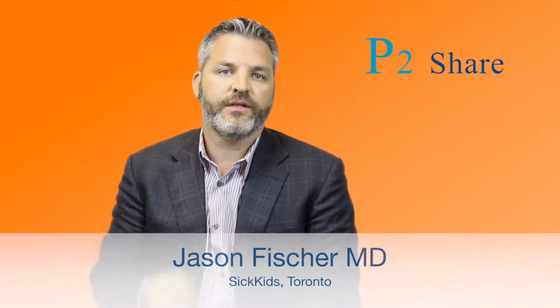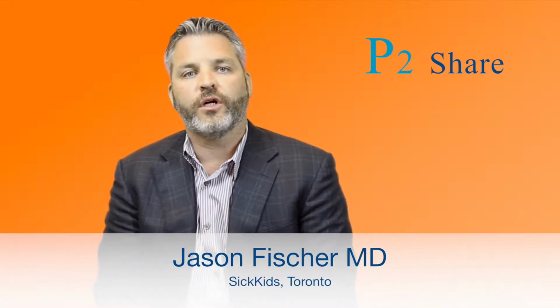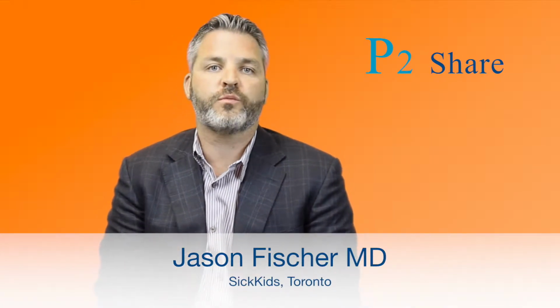So one of the common presentations to the ED is the swollen bump on the neck, or the lymph node. And lots of people approach this problem differently in their clinical practice. Well, point of care ultrasound can help you out a little bit as you're trying to determine whether or not you're dealing with an abscess or a necrotic lymph node, or if you're just dealing with a reactive lymph node.